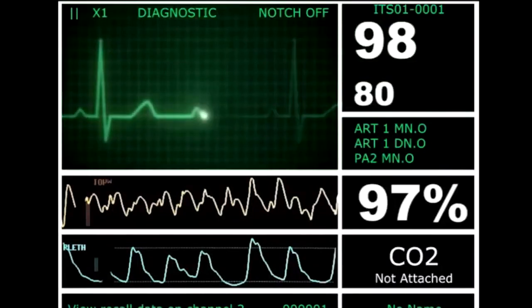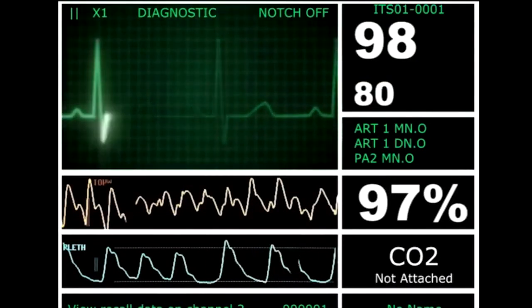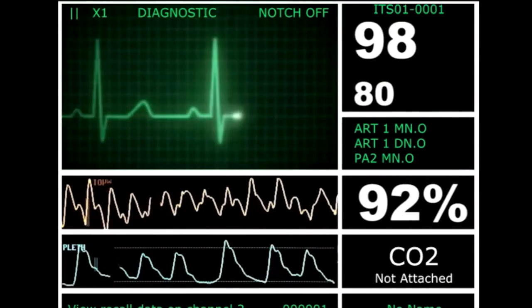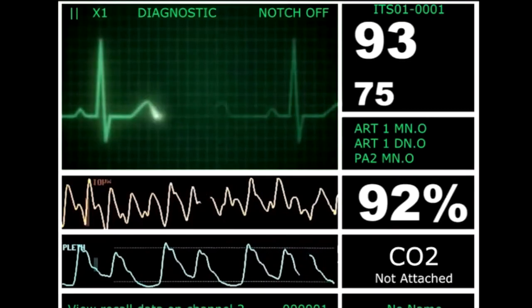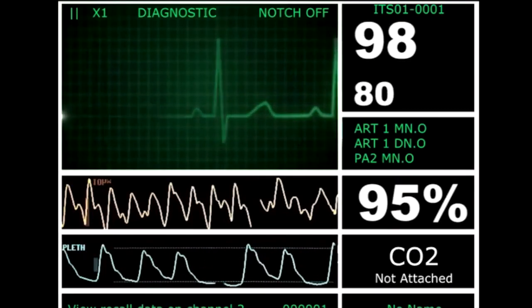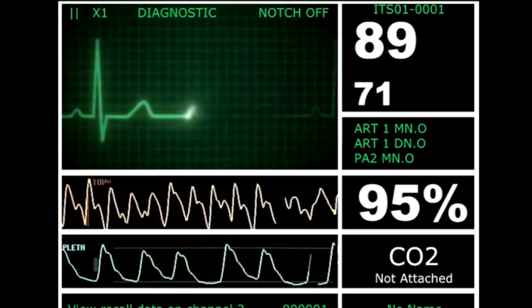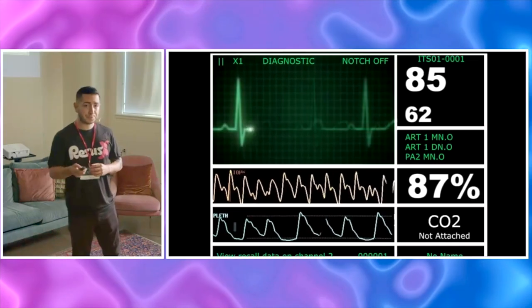And number two is that your patient should ideally not be in extremis, right? So this isn't a procedure for a patient who is severely agitated, someone who's peri-code or profoundly unstable, as you need time to perform this procedure, right? And ideally, you want to have someone who is somewhat cooperative in order to maximize your chances of success.